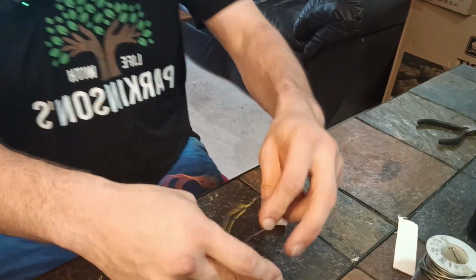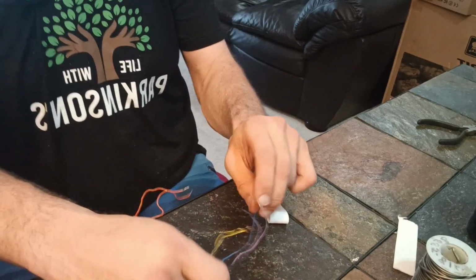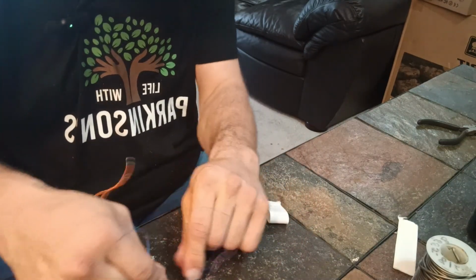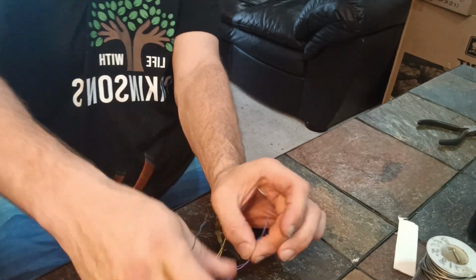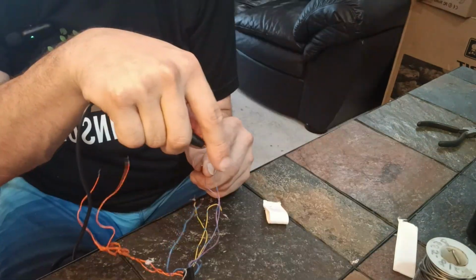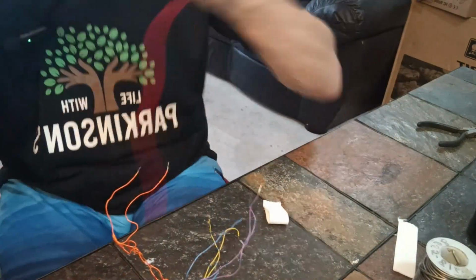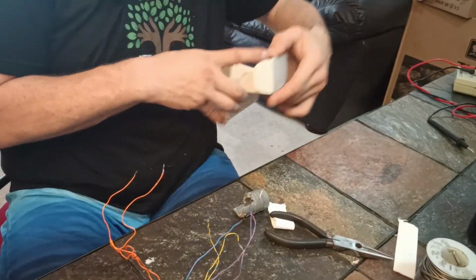All these worked, but some of the motors stopped working, so I'm assuming that I just damaged the wires. I just want to make sure all these pairs are working, and if they are, that will make the rest of this job pretty straightforward. Yeah, that's functioning. Oh, 4 for 4. Yeah, 4 for 4. They're all working. Okay, so now I just gotta attach the motors, and I have 5 left.